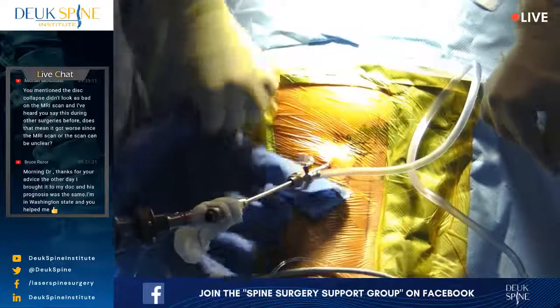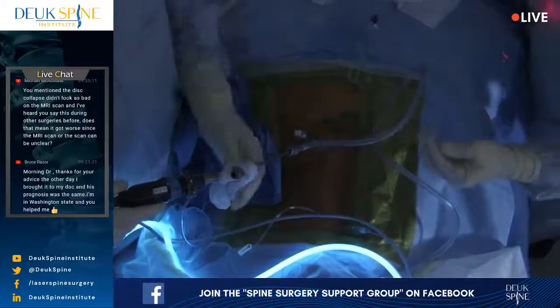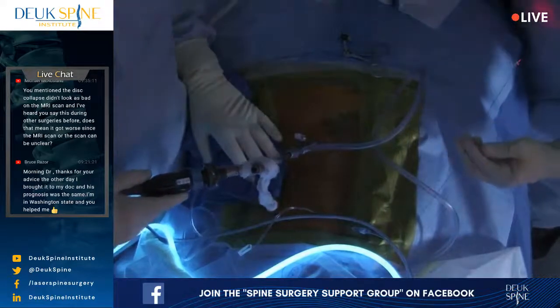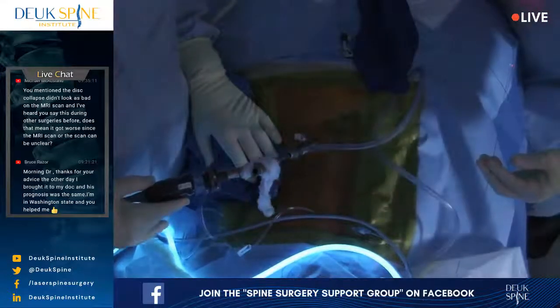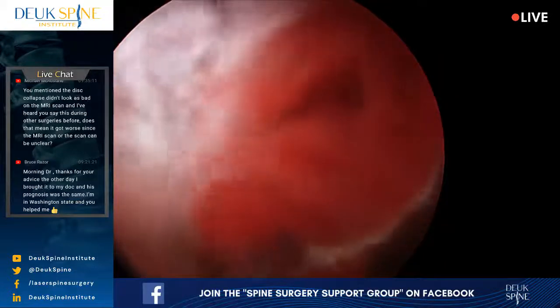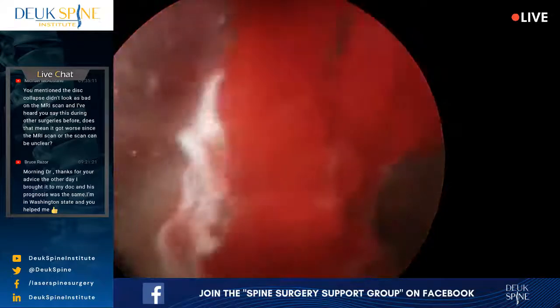And so I just kind of do the same thing, but it's not exactly the same thing, okay? So you can't say, you put your incision right here on this patient, so that's exactly where it'll be on the next one. Actually, that's not true. The incision on the next patient may be further to the lateral, to the side. It may be more inferior, it may be more superior. It all depends on their pelvic anatomy, like the anatomy of the pelvic bones and the facet joint and the disc. And where is the spine located relative to the back? So all those things have to be weighed in. And I do that without really talking about it to you because it gets too complicated and too babbly. And I don't want to babble you off of not watching because there's so much good stuff to see.